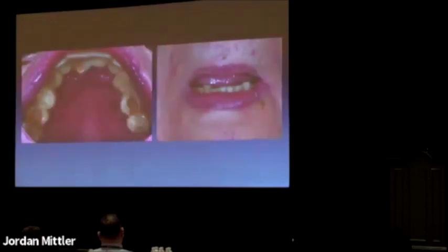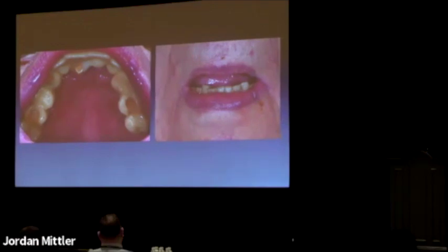Okay, and here it is. We were actually able to load 4 out of the 5 implants. Now look at his lip. When I show you the picture of his whole face, that's only like half of his upper lip right there. We've got a lot of coverage there.